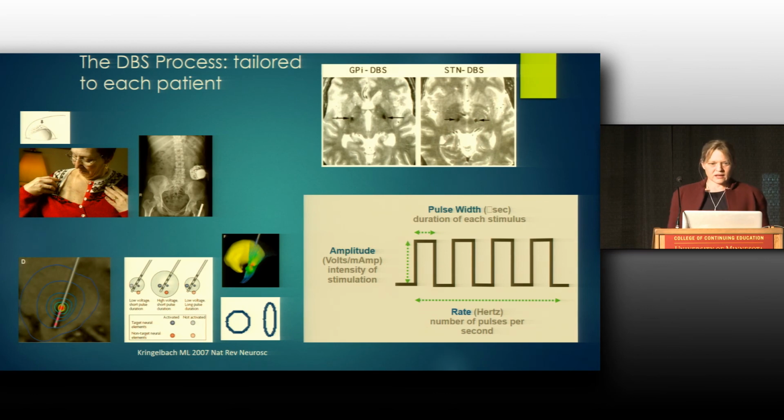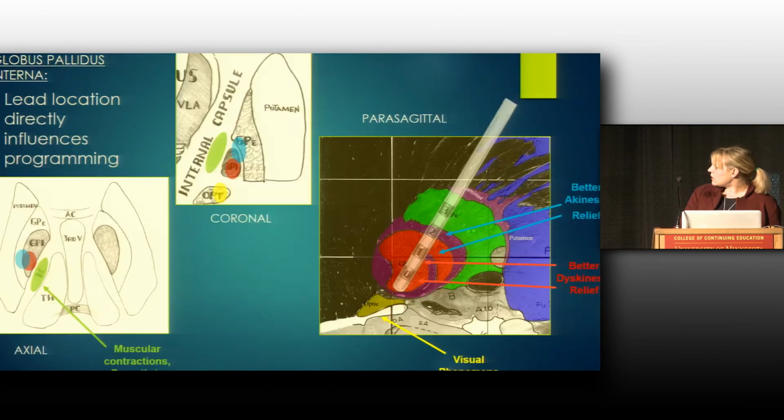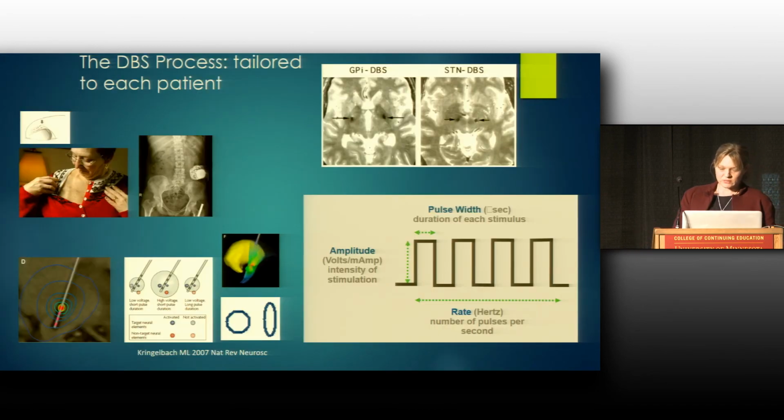In the clinic, another thing that I do afterwards, I have to figure out where to stimulate and what shape to stimulate and figure it out so it fits with your brain. And I have different ways I can do that. I have the stimulation pulse that's happening, but then I can change the configuration so I can change the shapes depending on how I activate the different contacts. Because you saw those funny shapes that we had before. They're not just circles. I have to shape things to fit in there sometimes depending on where it is. So I have to know my physics to properly treat you. And my electricity. My husband tells me I'm an electrician.